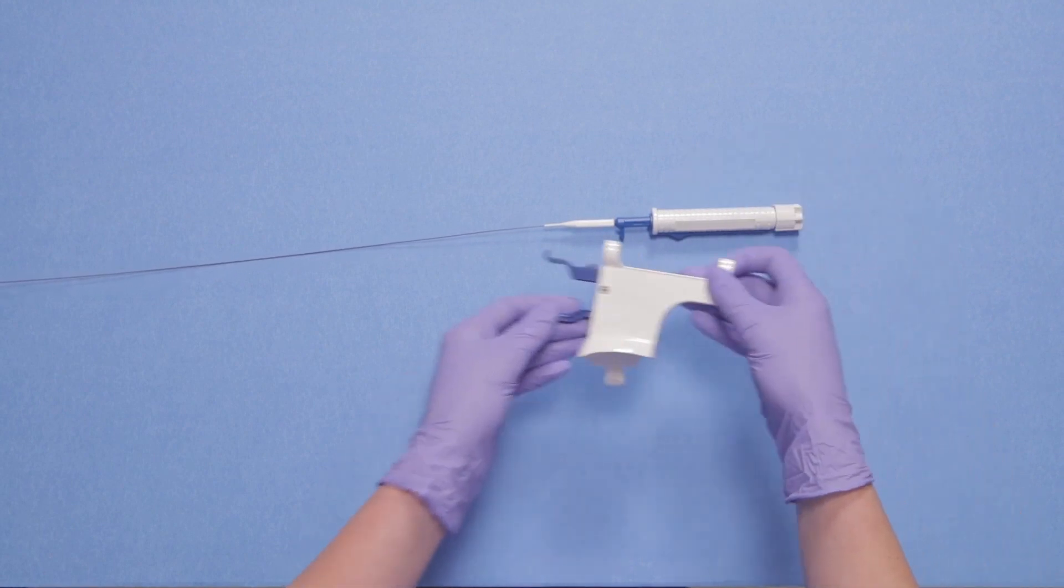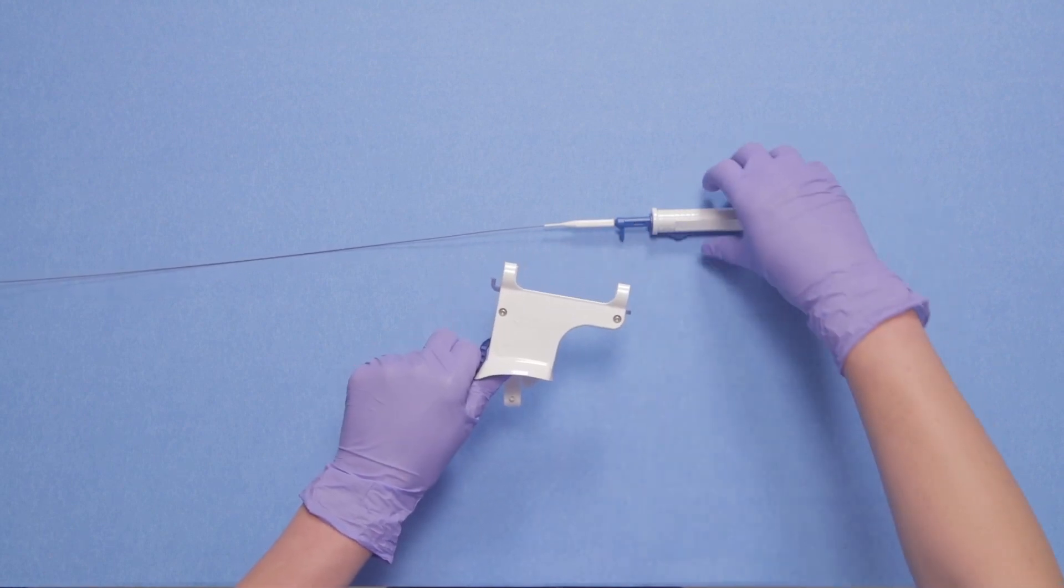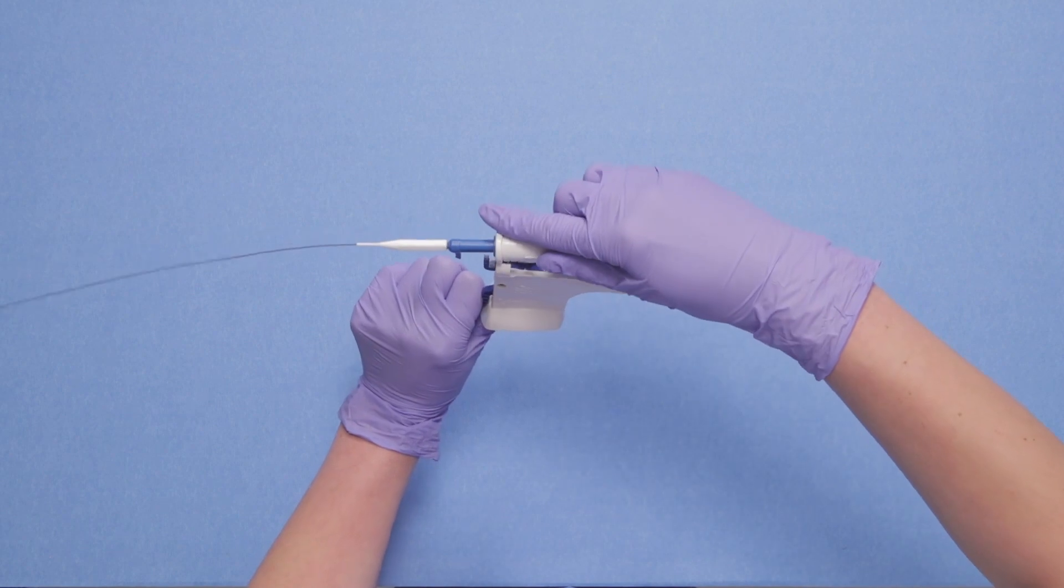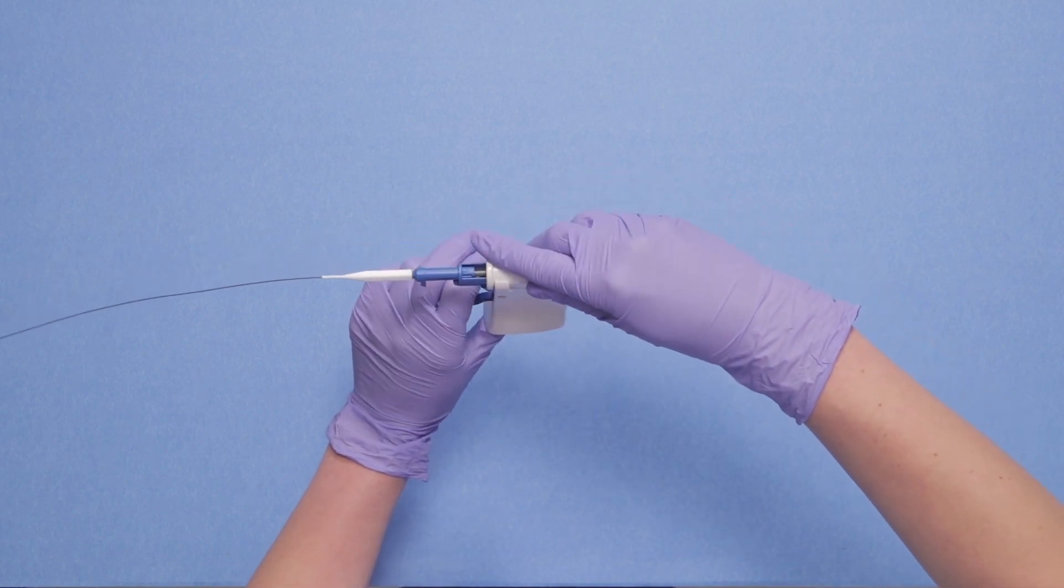Next, pick up the LithoVue Empower device and hold down the trigger. Snap your Boston Scientific retrieval device into the Empower device by matching the blue ridge on the handle to the blue indentation on the LithoVue Empower device. The handle will snap into place when secured correctly.